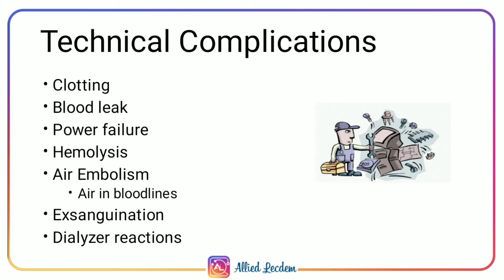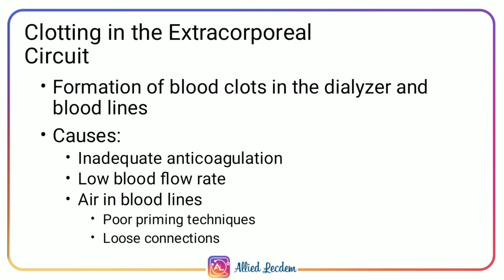The technical complications are clotting, blood leak, power failure, hemolysis, air embolism, exsanguination, and dialyzer reaction. Clotting in the extracorporeal circuit is the formation of blood clots in the dialyzer and bloodlines. Causes: inadequate anticoagulation, low blood flow rate, air in bloodlines.